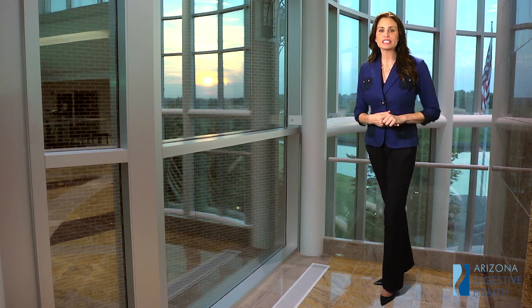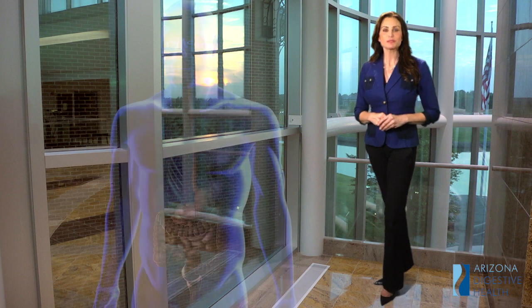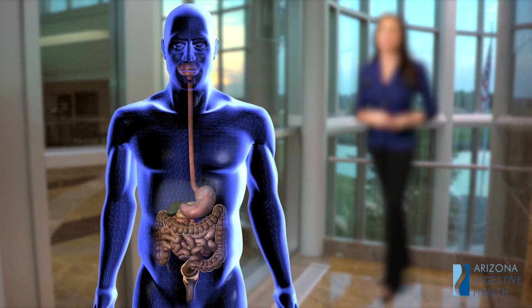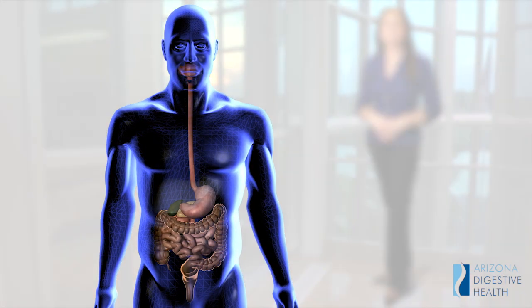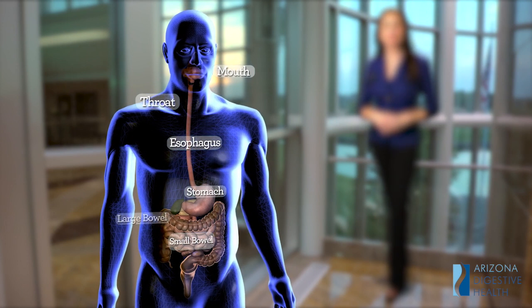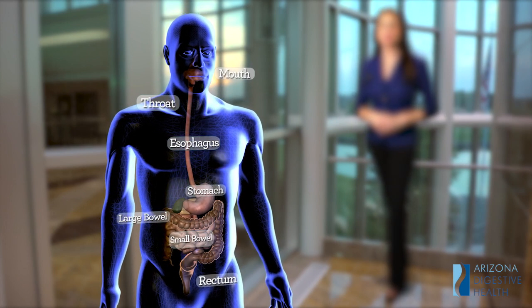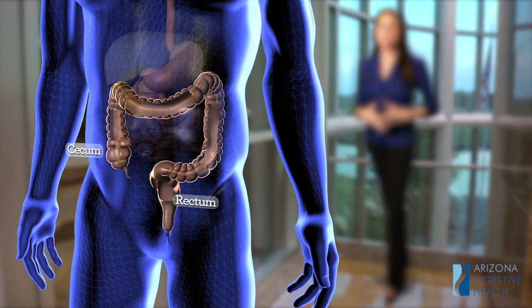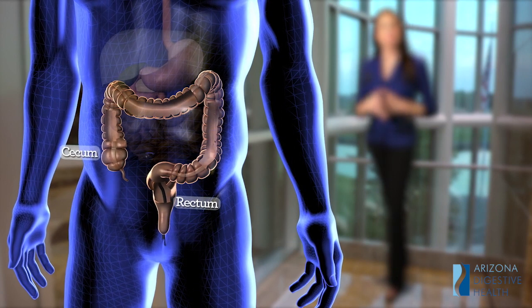To help you better understand sigmoidoscopy, let's first look at how the body's digestive system works. This digestive system is also known as the gastrointestinal tract, the GI tract for short. The GI tract includes the mouth, throat, esophagus, stomach, small bowel, and large bowel. The lower part of the colon is called the sigmoid and ends in the rectum. Part of your lower GI tract can be examined with the use of a sigmoidoscope.